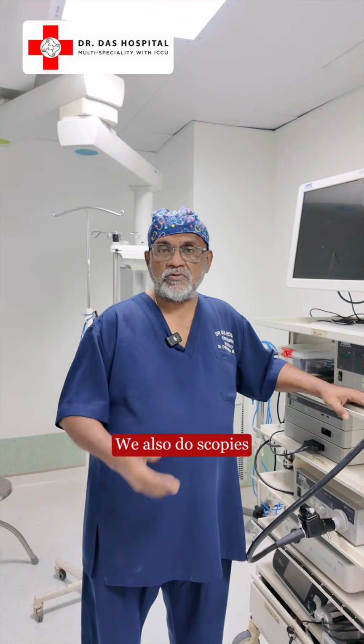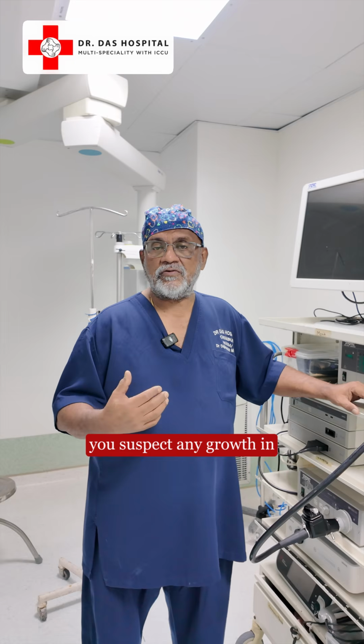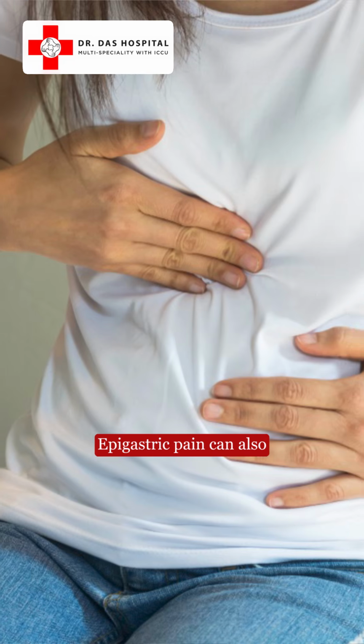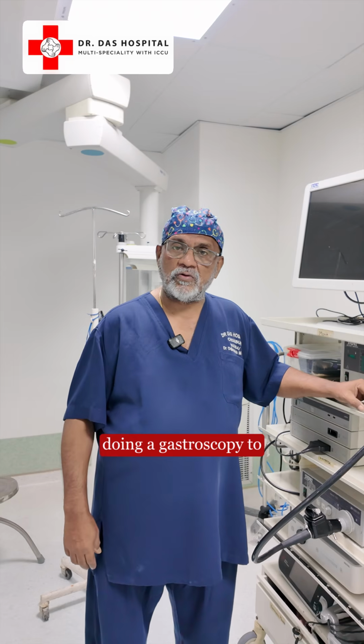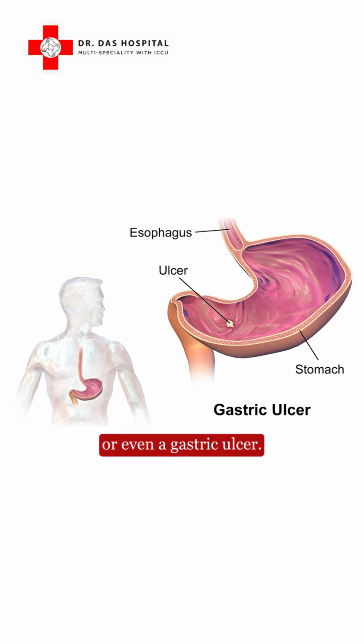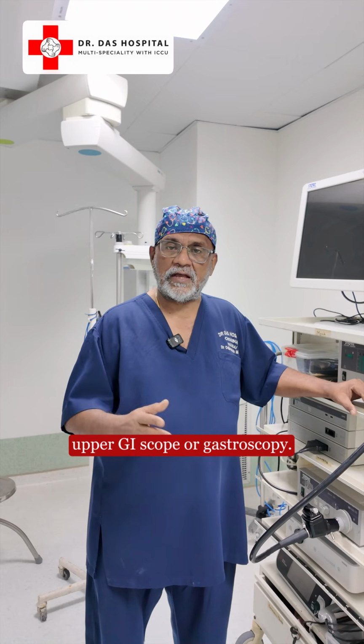We also do scopies whenever there is hematemesis, that is vomiting of blood, or if you suspect any growth in the stomach or the duodenum. Epigastric pain can also be an indication for doing a gastroscopy to rule out any duodenal lesion, like a duodenal ulcer or even a gastric ulcer. So these are the primary reasons for doing an upper GI scopy or gastroscopy.